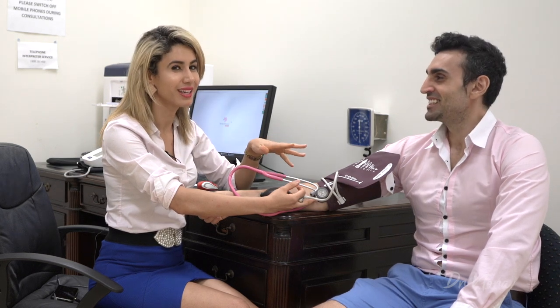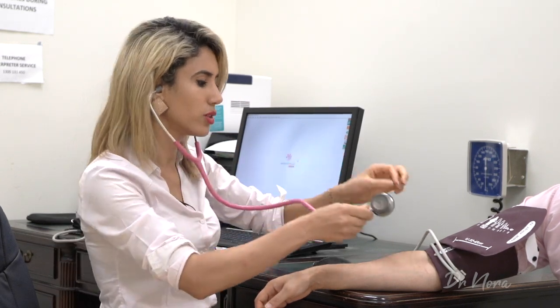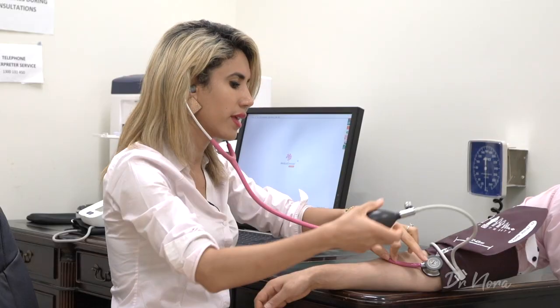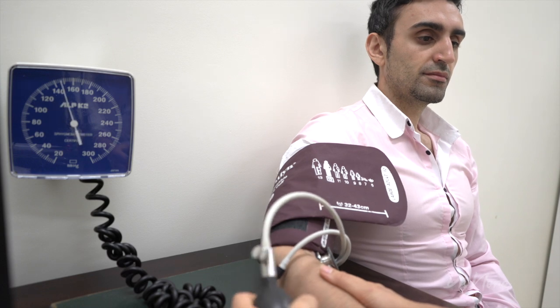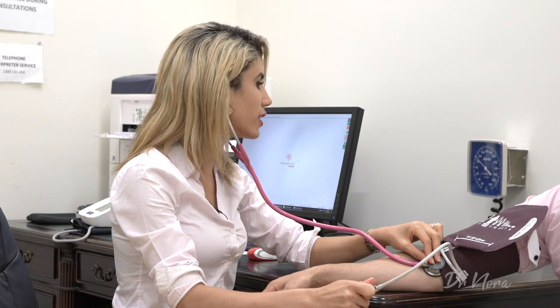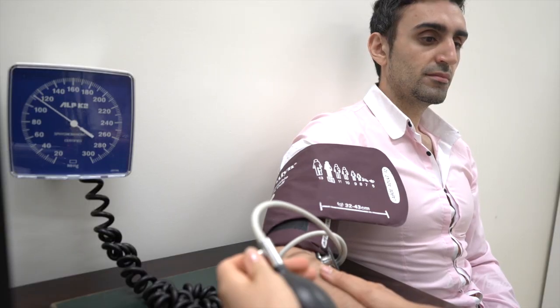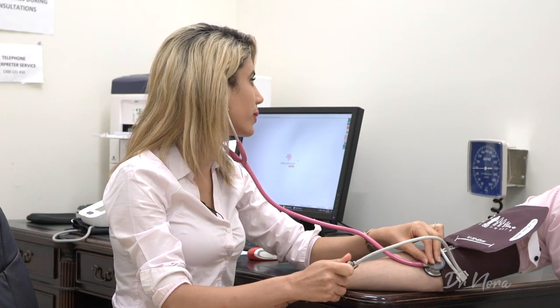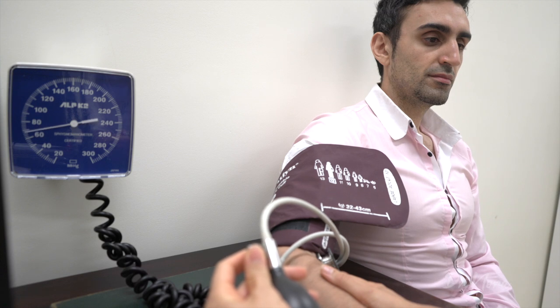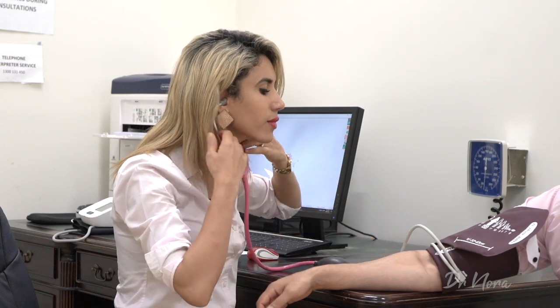So let me show you again just one more time. Making sure the valve is closed, putting the stethoscope into the ears, diaphragm onto the antecubital fossa over the brachial artery, inflating up, and slowly releasing with the valve turned — listening out for the first noises, which are the systolic pressure. I can hear that at 90 and I'm going to continue listening until it fades away. And once you can't hear it anymore — which is 63 — just deflate the cuff all the way and remove your cuff.